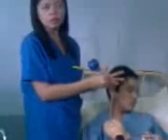Okay, so after aspirating, the tube is in the stomach of the patient if the stomach content can be aspirated. So how will you know the stomach content? What will be the color? It could be green or yellow, so greenish. So pag aspirate ninyo, yung content ng patient, meaning this will be the correct position.